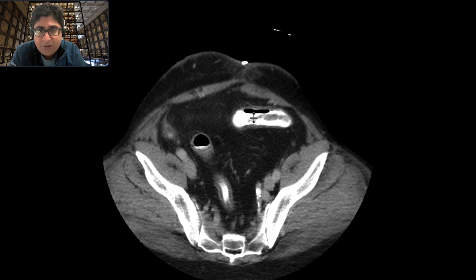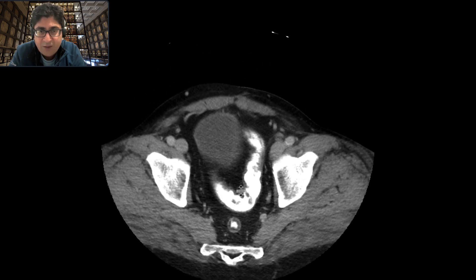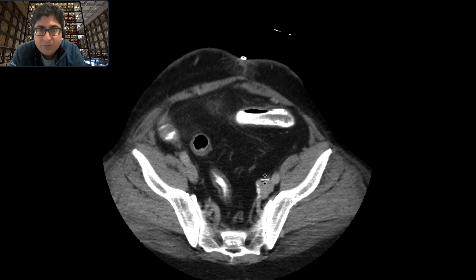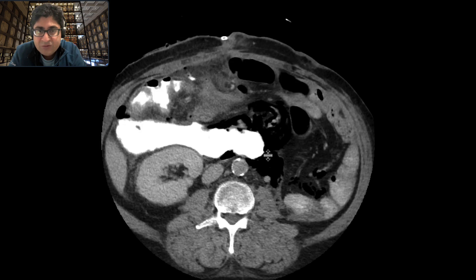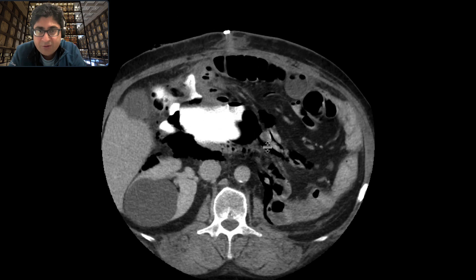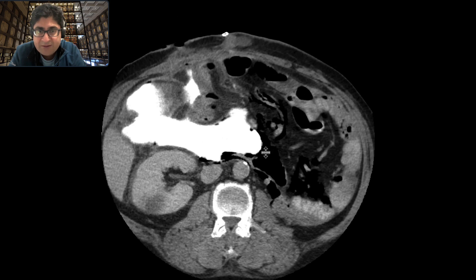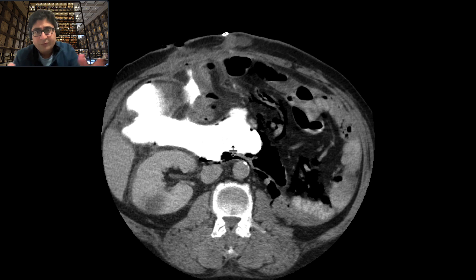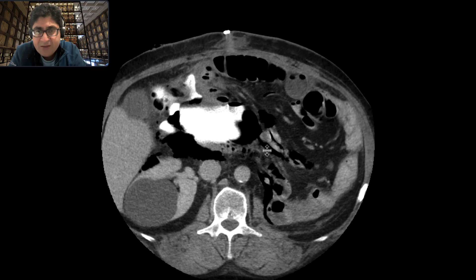You can see bowel loops here. This is large bowel with some of the rectal contrast. This is the sigmoid colon with some of the rectal contrast. But this structure here looks like it's free and sort of floating around within the abdominal cavity.